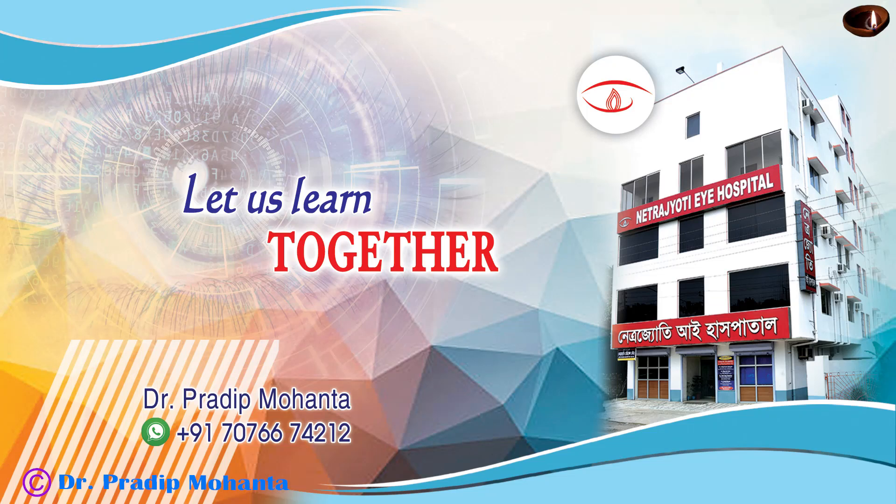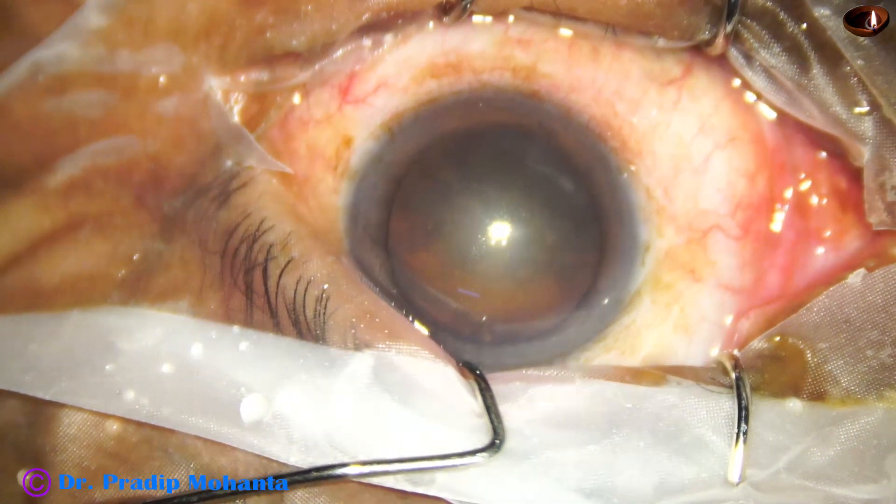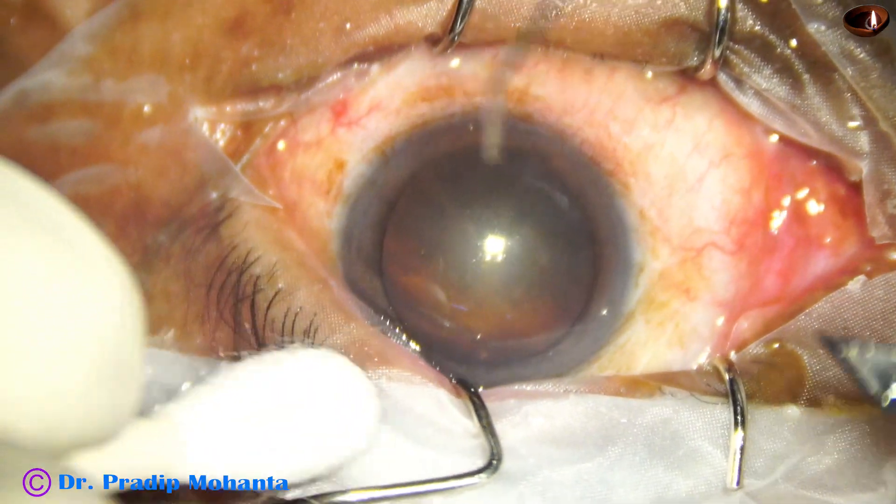Welcome to my workplace at Rana Ghat, West Bengal, India. Let us observe this totally unedited phacosurgery.